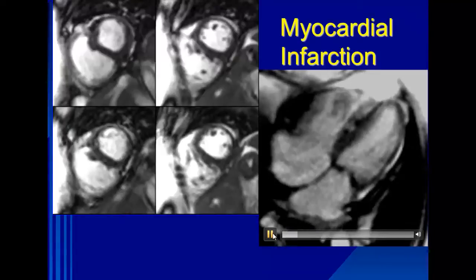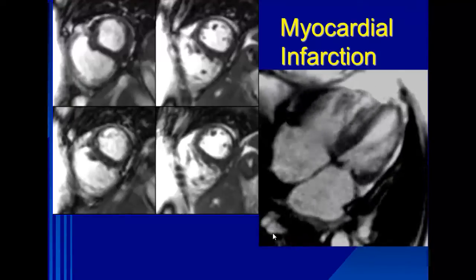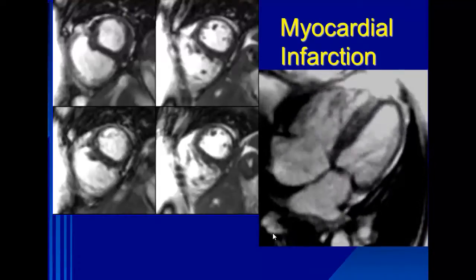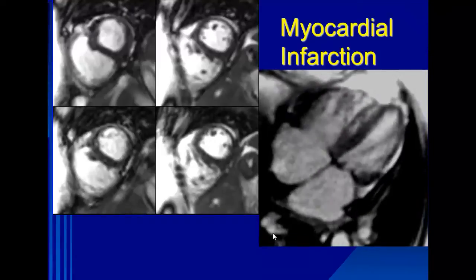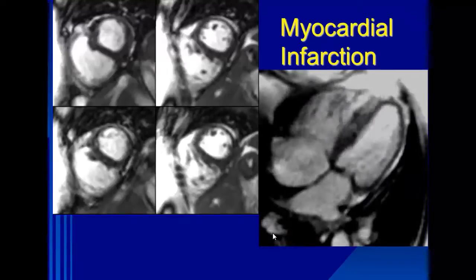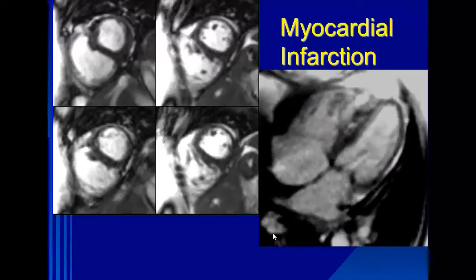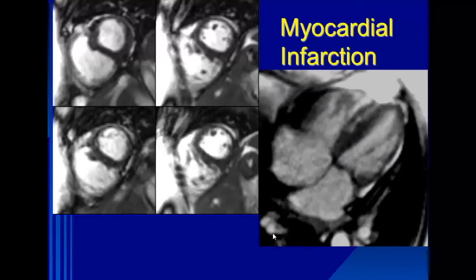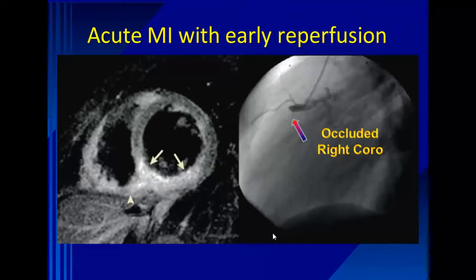Here in this image, and it's really interesting, I don't know why some did capture and some didn't. Here you see this is a 4-chamber view of the heart. Here is the interventricular septum, the mitral valve, okay? And you can see how the septum and the apex are thickening. But if you look here, you see that the lateral wall is thin and akinetic. Even though it looks like it's moving, it's really not moving at all. So identifying myocardial infarction is another great trick.